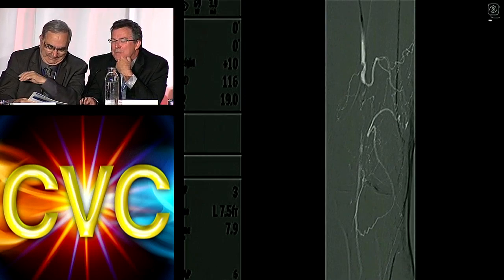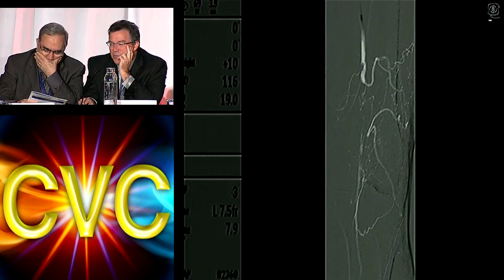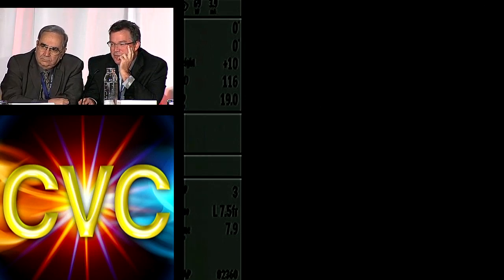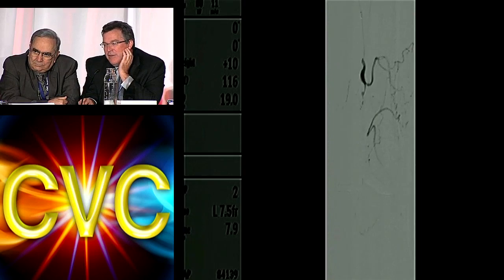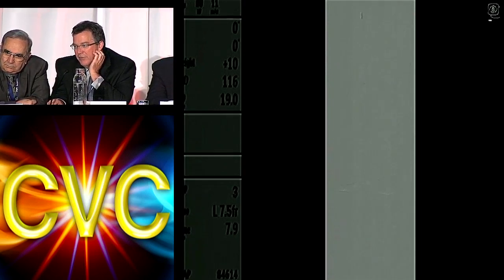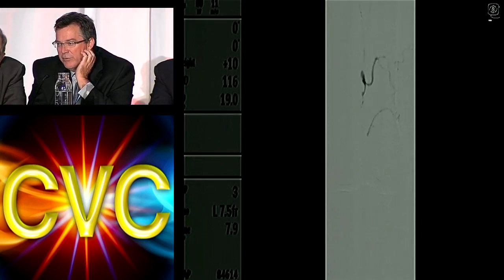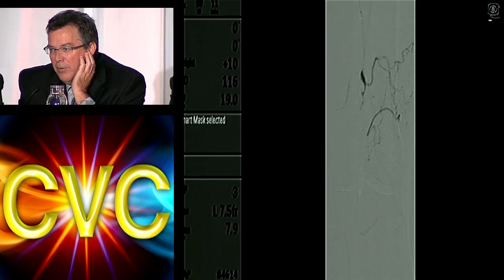Anyways, I think the problem with treatment here is that you really won't know what you can do till you cross this, because it'll depend upon if you're subadventitial, how far you've extended this with wiring. I'm a big proponent of crossing devices, and this is one of those spots where they are very good, because, as Craig pointed out before, there is a mismatch between the vessel size proximally and distally.